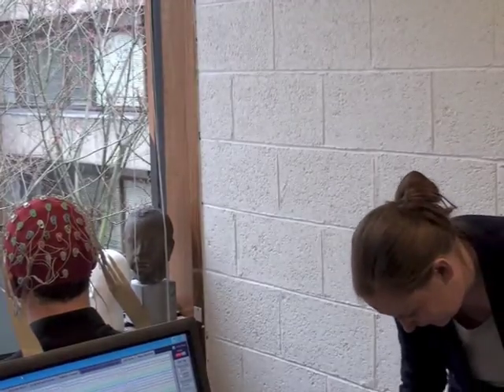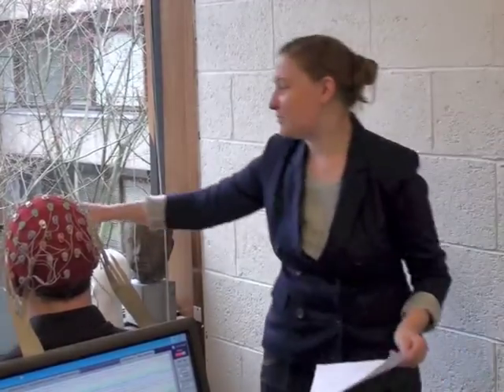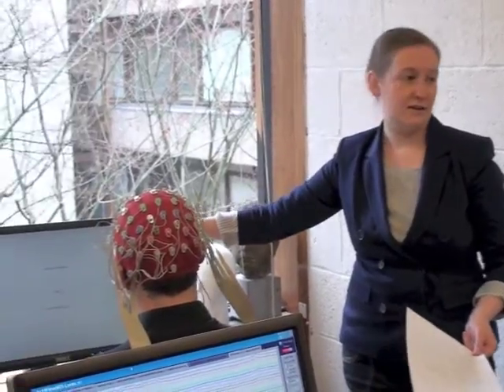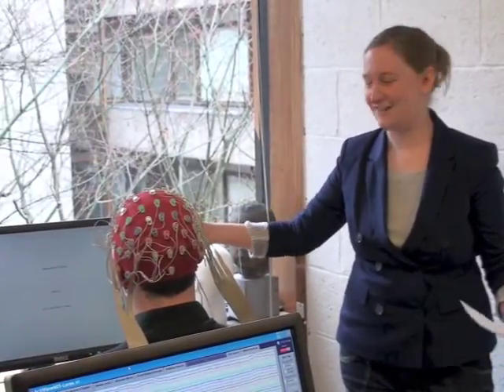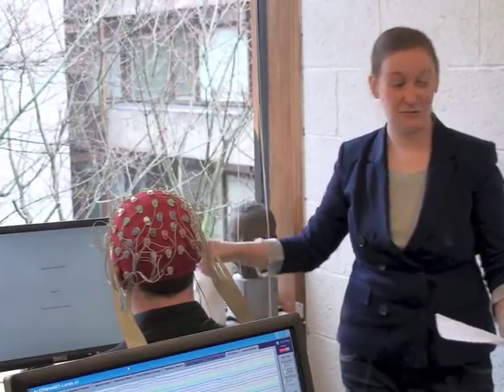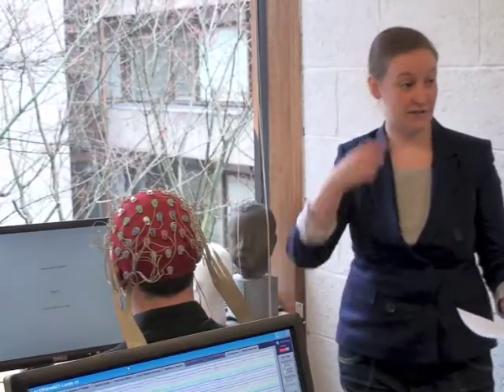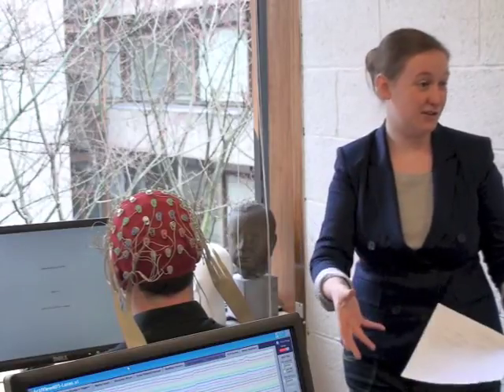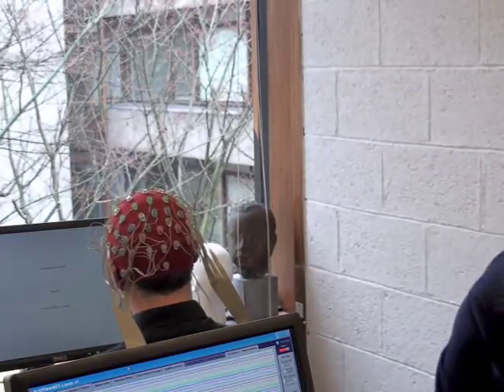Oh yes, please remember the screen resolution. Just remember that's just a general psychophysics thing. When you're running the experiment in EEG, it's really important if it's visual, when you write your paper, to say what the screen resolution was. It's really important, because you need to be able to go back and measure the images and all that, and the distance away from the screen. But that's just general psychophysics.